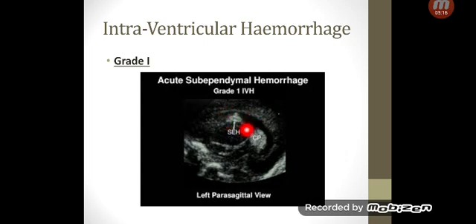So this is how a grade 1 IVH can look. It can look less pronounced than that, but this is how it can be really obvious from our angle as pediatricians. So this is a grade 1 IVH.